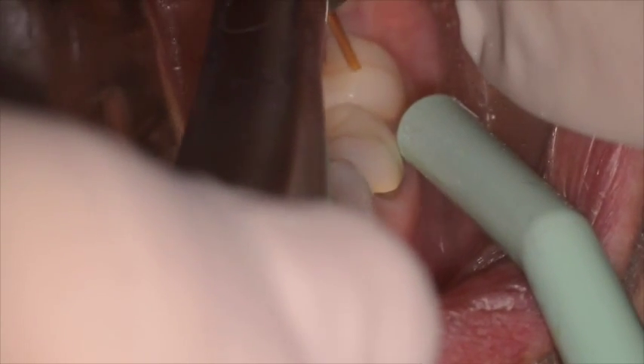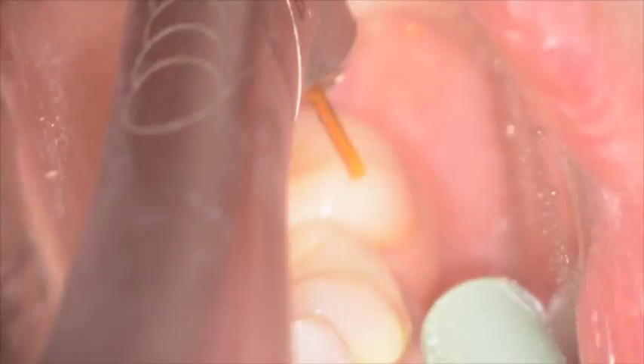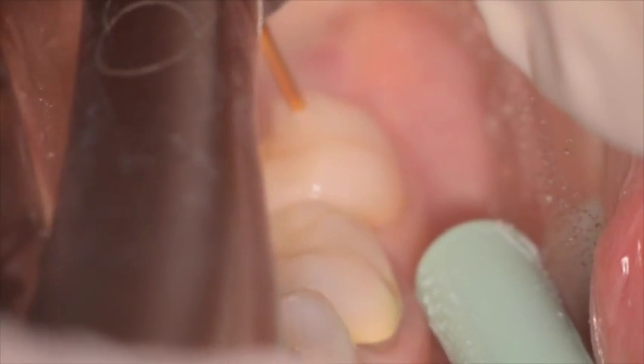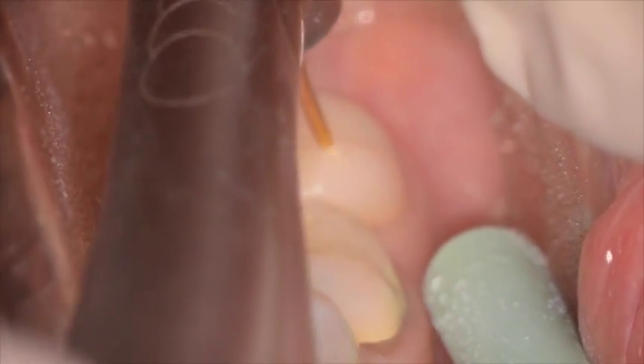The tip is carried just out of contact and slowly moved over the remaining porcelain surface, interacting by transmitting through the porcelain with the silane bond and weakening that bond. This allows you to remove the fractured portion of the crown by mechanical means.